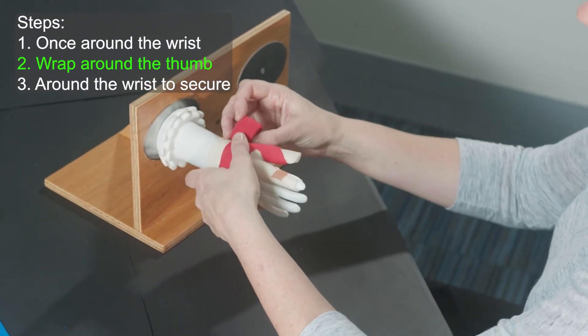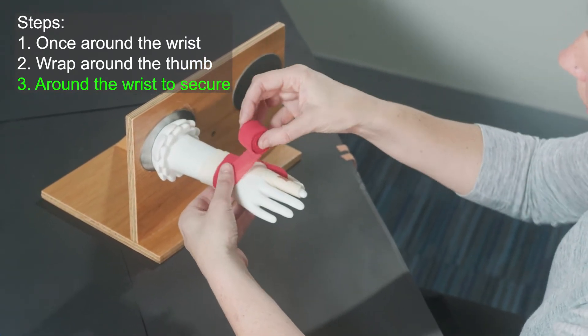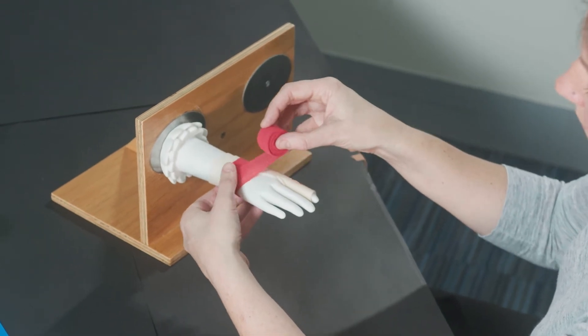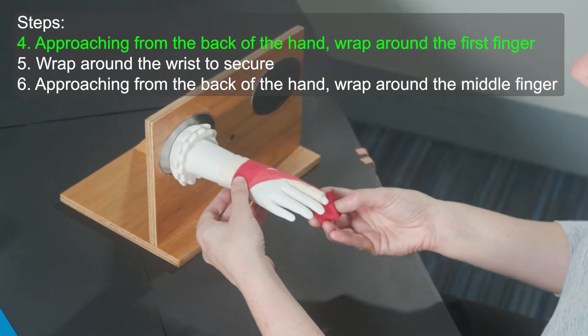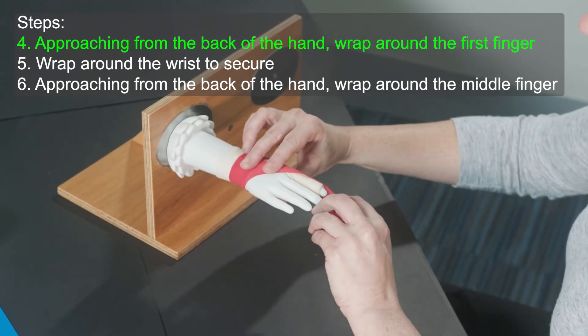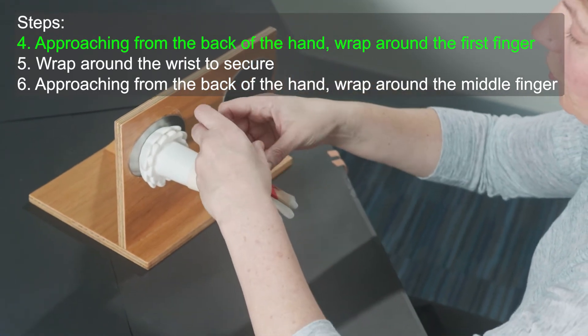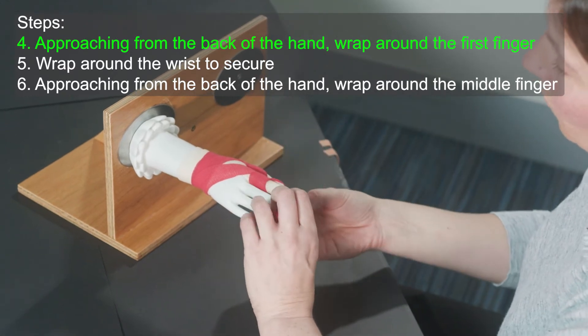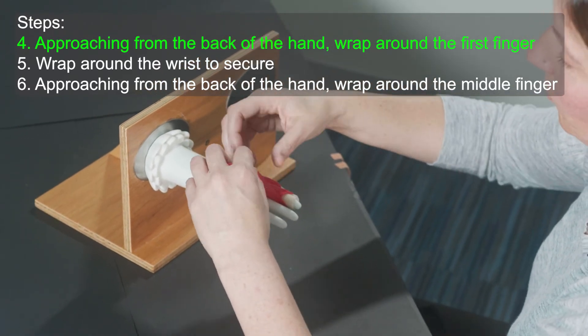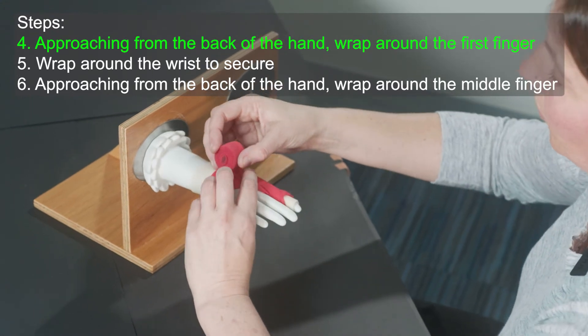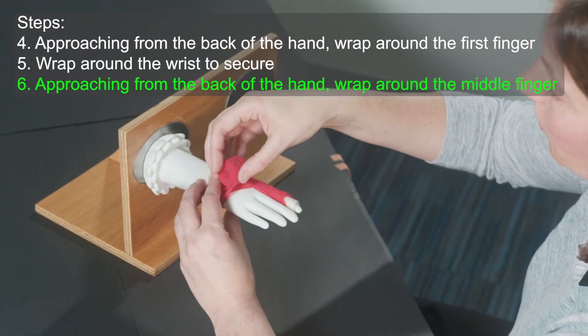Once you're done wrapping the thumb, you're going to still continue to wrap around the hand, and we're going to do the wraps for each of the fingers from the back of the hand. You're going to come around the front and you're always going to start at the thumb side of each finger. You're going to very gently hold your dressing in place while you're bringing it through the web space. You don't want to put too much tension on the bandage. For today, I'm just going to show you one wrap around each finger. Trying to keep your wraps nice and flat, not putting too much tension as you come back to the wrist.